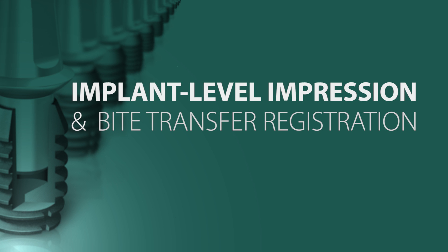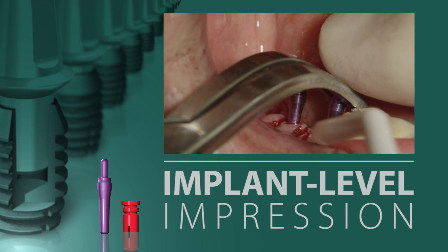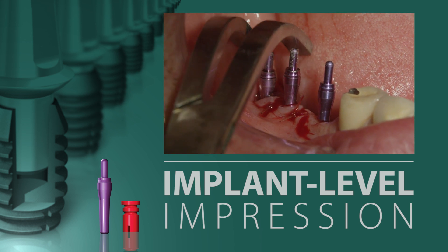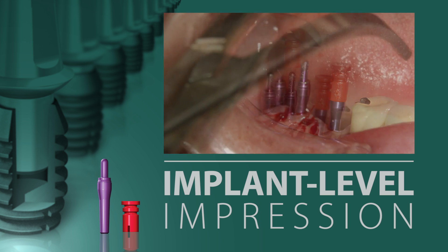This video will demonstrate the proper technique for the making of an implant level impression and bite registration. After uncovering the implants and removing the black healing plugs, or if it were a one-stage surgery, the healing abutments, impression posts are placed into the well of the implants with finger pressure, prior to the plastic impression sleeves being snapped onto the impression posts.